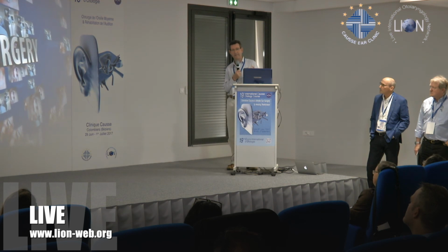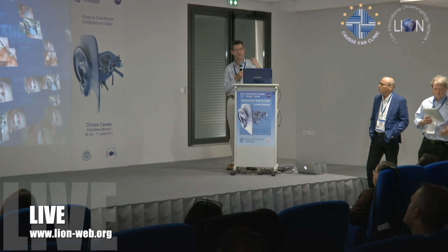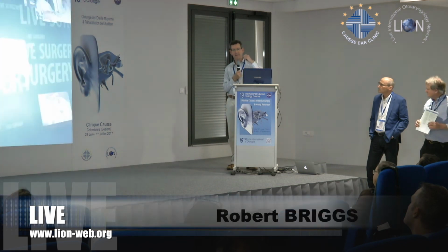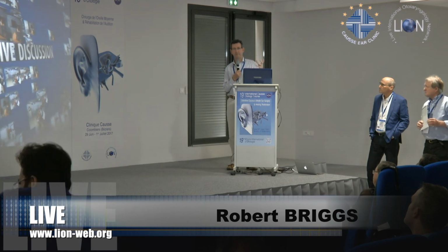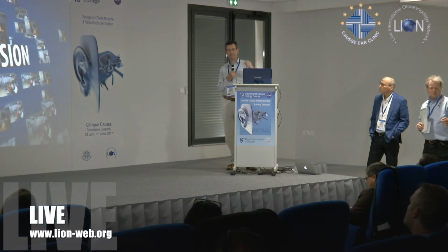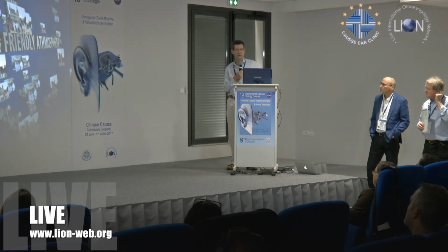Interestingly, my dental colleagues tell me that with the oral cavity and dental implants, it's well known that if you have a depth of soft tissue greater than 12 millimeters, you have problems. So I think it's related to that depth of tissue, and it's not so much the coating.